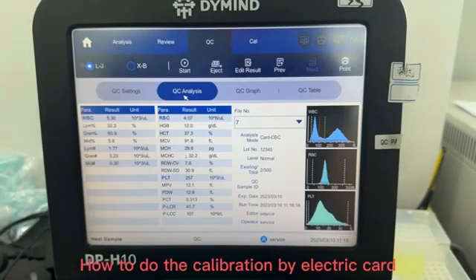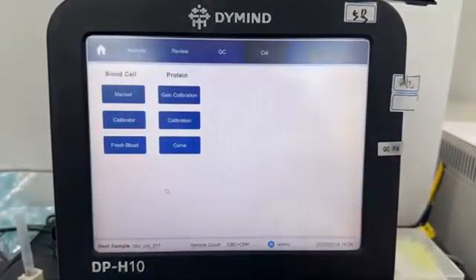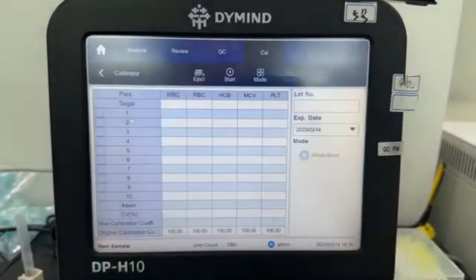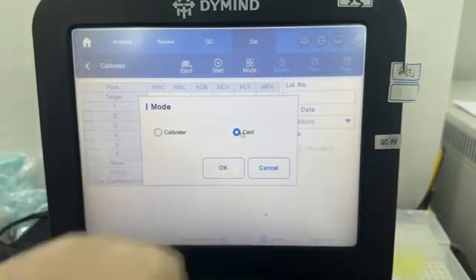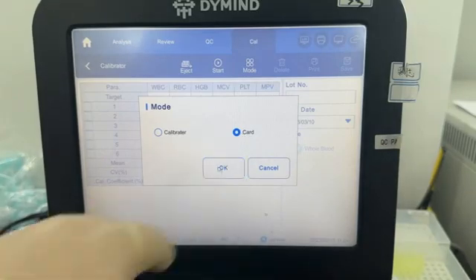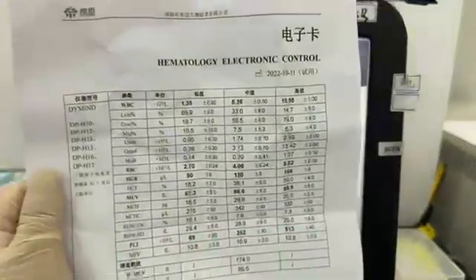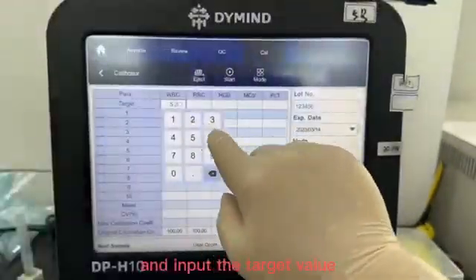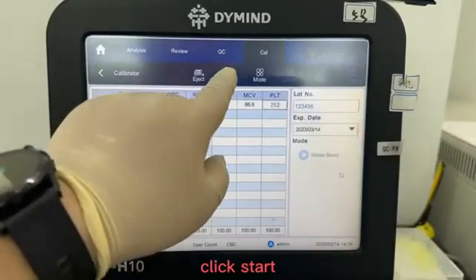To do the calibration by electric card, go back to the home interface. Click Cal, click Calibrator, click the mode and select Card. Input the lot number and expiry date as you want, then input the target value. Click Start.